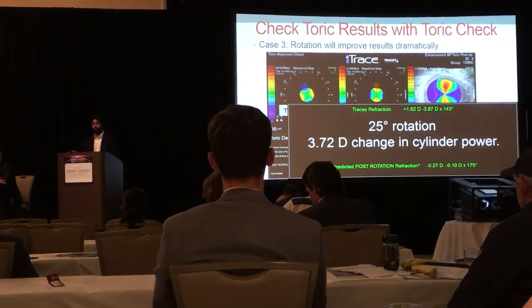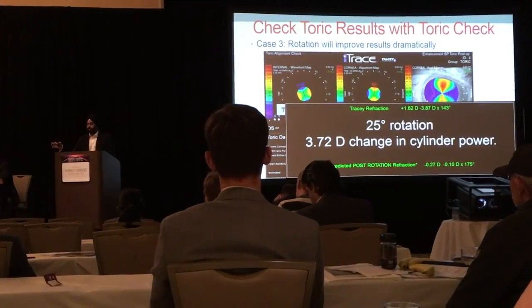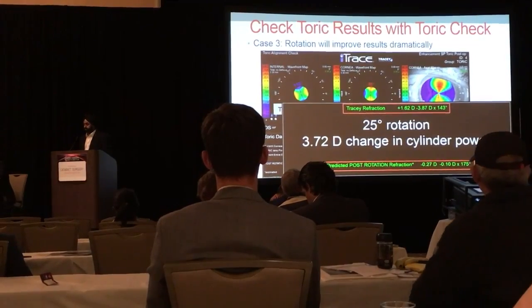So you can go into a patient's room and say, look, Mrs. Smith, I'm really sorry, I know you're not happy, but I'm going to do this, this, and this. I know for sure we're going to be on target and be very happy again. So it really helps with that insecurity when you go into that patient's room.